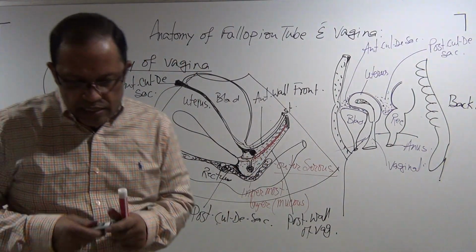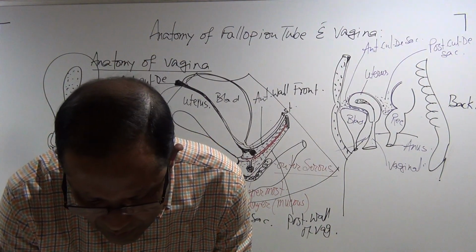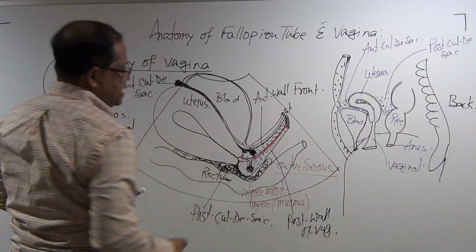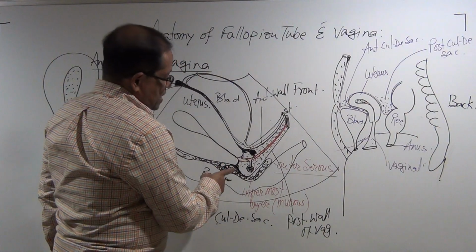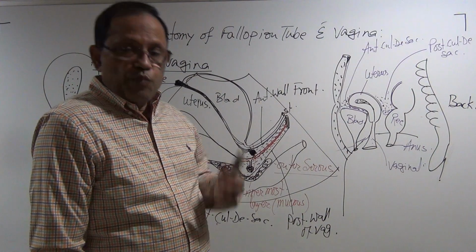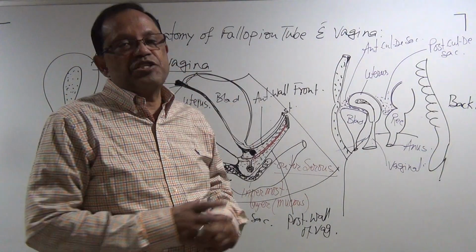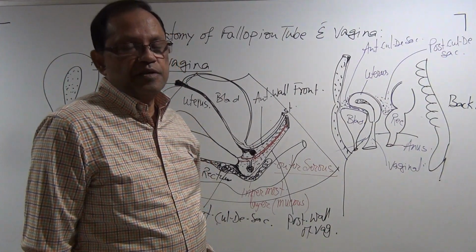Let me say its name. No, it's not here, but I will give you the name. What is the name of this area? But make sure that sonographically you can recognize that area. The posterior area is more capable of collecting any secretion, including sperm, discharge, semen. Okay?